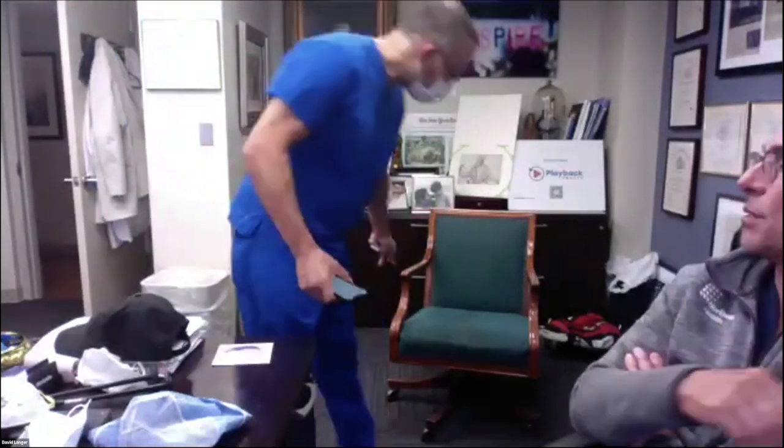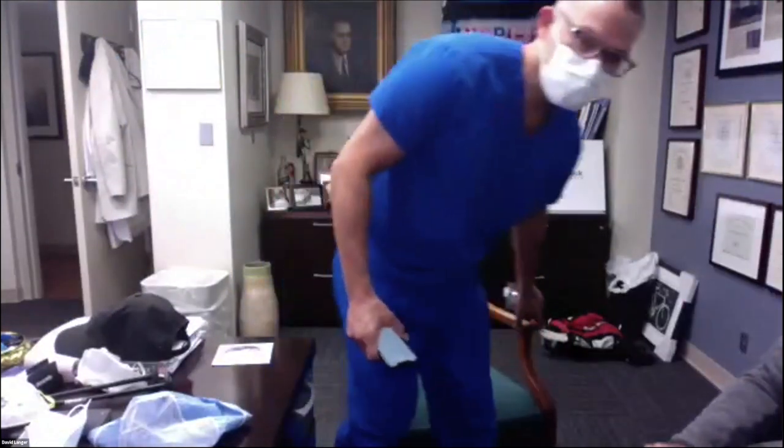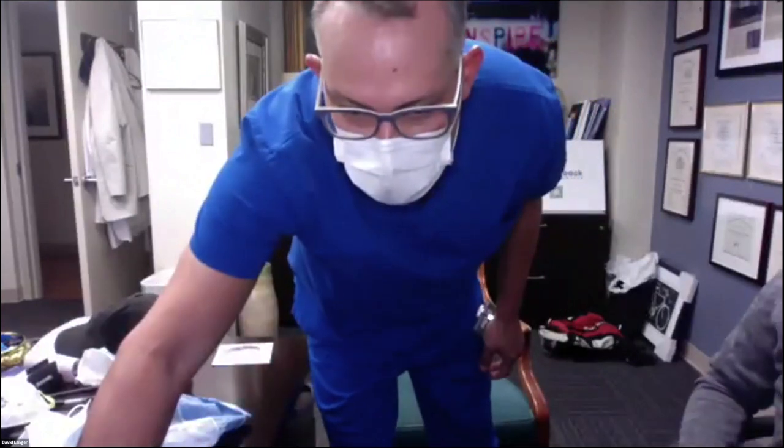But here's Dr. Ortiz. We just watched you do that. Yeah, why don't you describe to them what you did? I went over the whole case while you were doing it. I showed them how you had the first coil in, and the second was kind of coming out a little bit. You were playing with it, and you finally got it to set. Yeah.